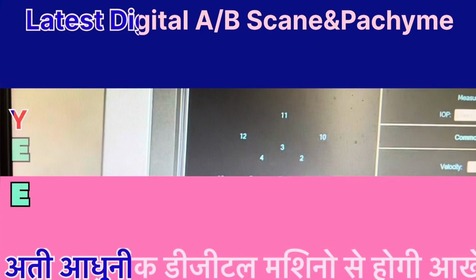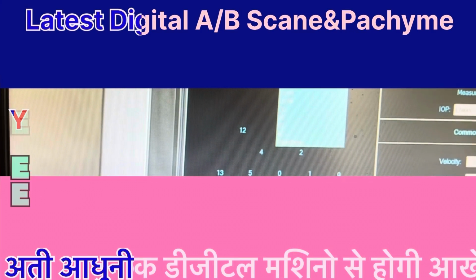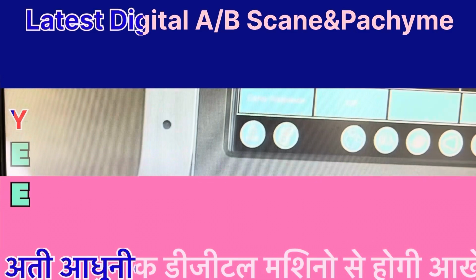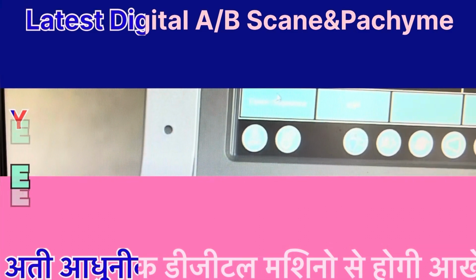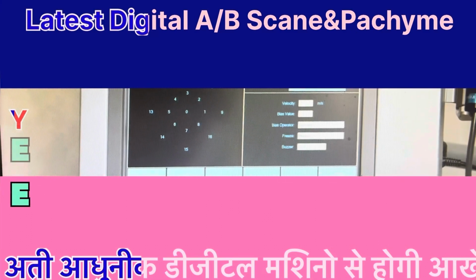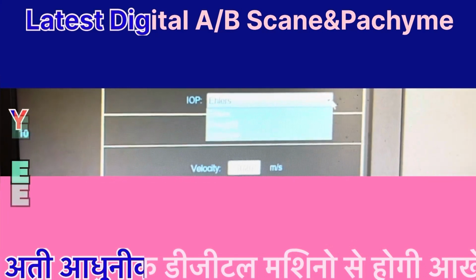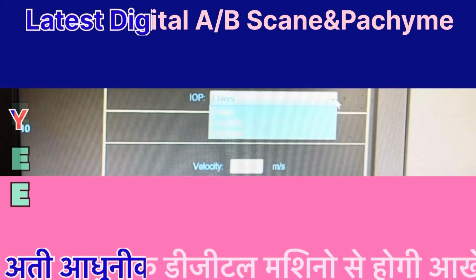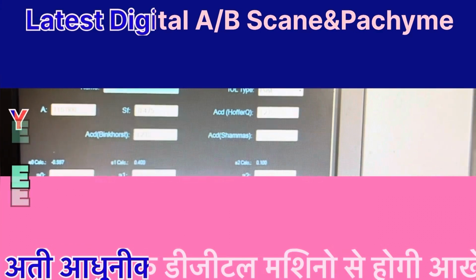The default selection field allows the examiner to specify the default layout of the Pachymetry acquisition screen. 4 acquisition modes are available: center only, automatic, continuous, or scanning. The examiner can also choose from 8 predefined mapping sequences using the Mapping pull-down menu. Alternatively, a custom mapping sequence can be created by selecting Enter Sequence from the bottom toolbar.